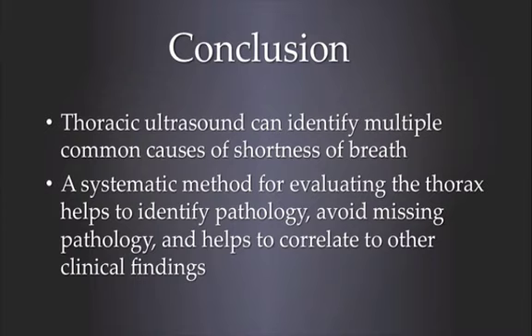So in conclusion, thoracic ultrasound can be used to identify multiple causes of shortness of breath. A systematic method for evaluating the thorax helps to identify pathology, avoid missing pathology, and helps to correlate to other clinical findings.